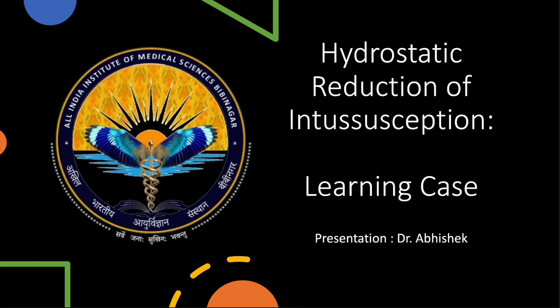Hello everyone. So today I will be presenting before you a procedure of hydrostatic reduction of intussusception which we did in our department under USG guidance. So it will be a good learning case. Just go through this whole presentation.